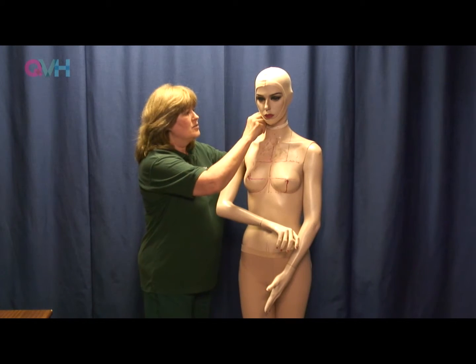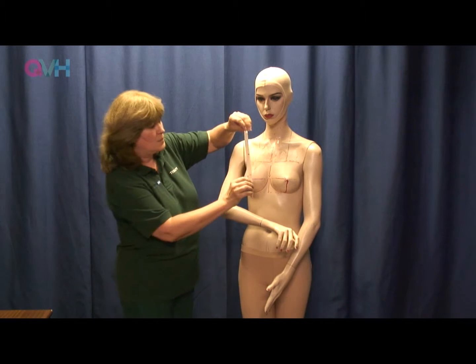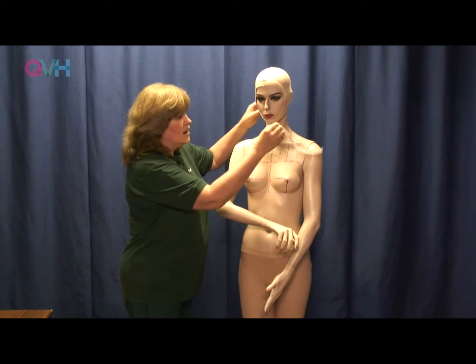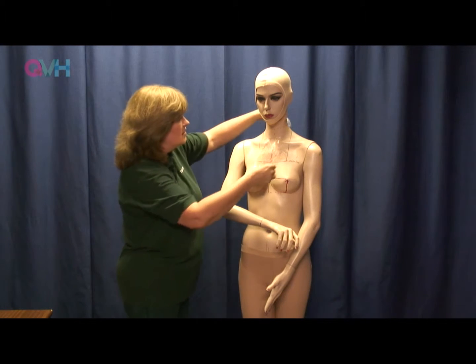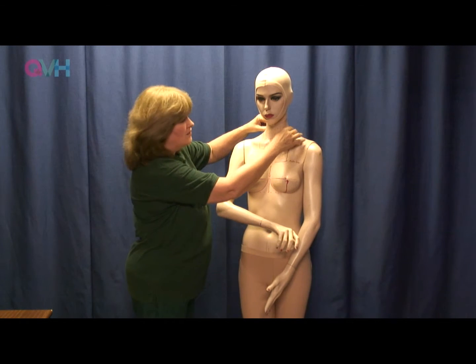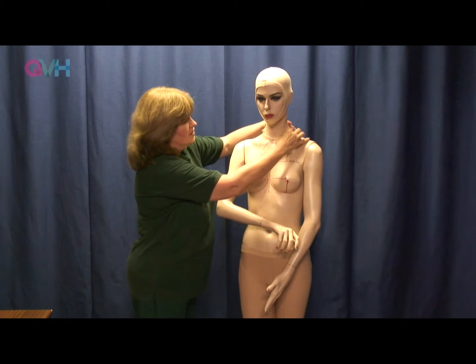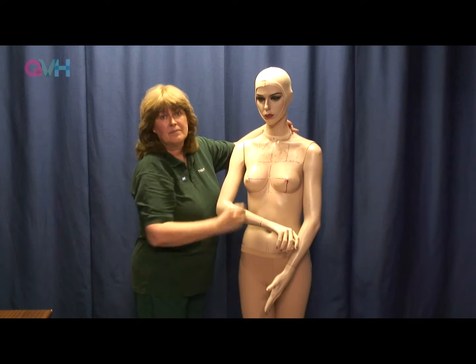You'll notice I also have 3 marks on this elastic, because when I've measured that distance, I don't reduce it, but I divide it by 3. The reason is, one third is usually the back of the neck, and the other two thirds form the neckline from side to side.